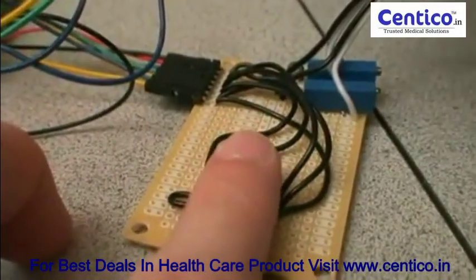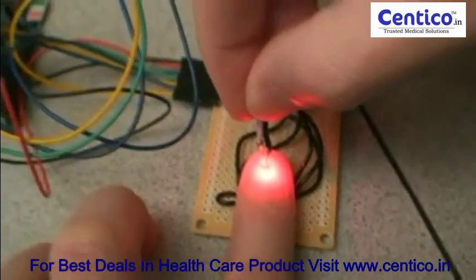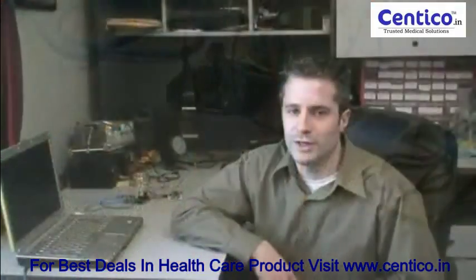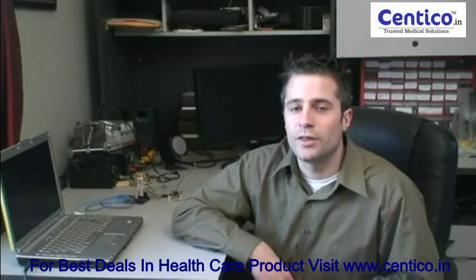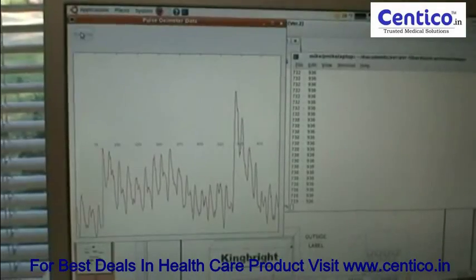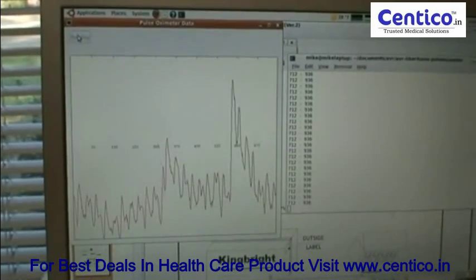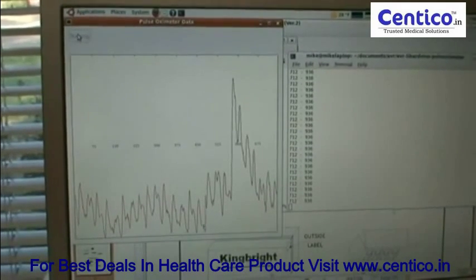If we place our finger over the sensor like this and then get our light source and put it behind our finger, what we're measuring is the amount of light left over after it's been absorbed by our finger. With the red LED, we're shining a red light through our finger — some amount of the red light is being absorbed by our pulse, and we're measuring just the leftover light that has not been absorbed.